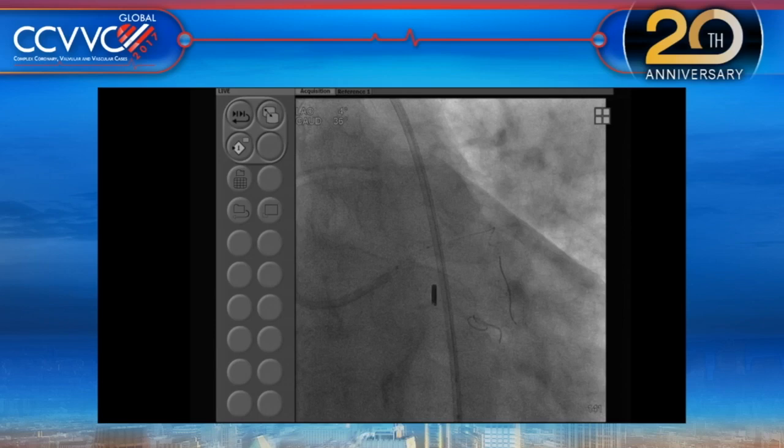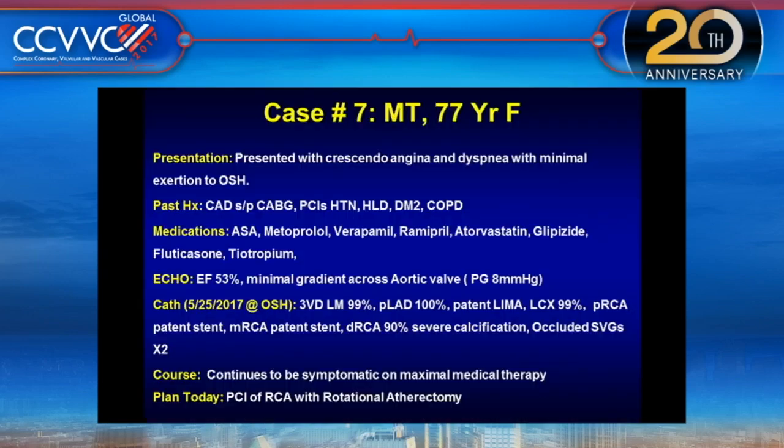All right. So if you don't mind, we're going to go to Dr. Sharma. Yes. Thank you. Excellent. Hello, Dr. Sharma, case number 7. Yes. All right. I hope this one is radial because I see Nitin. Yeah, actually the radial is included here. So even the radial, but it has to be femoral again. Okay. But I know the time issue, and knowing that we can always use our associate. So this is a little difficult situation.